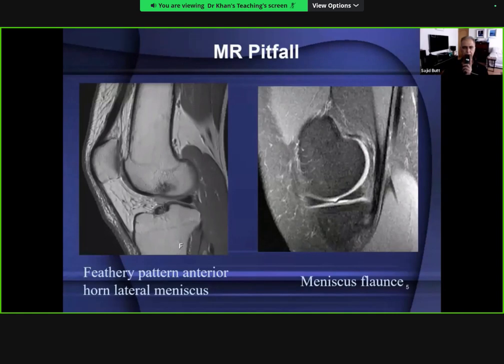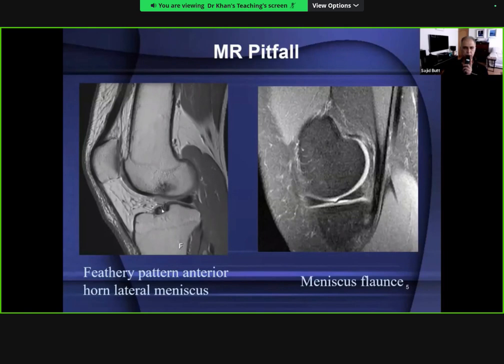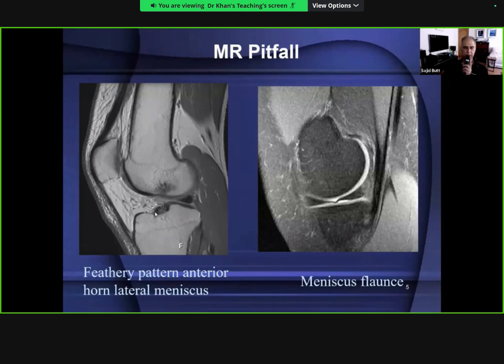A pitfall: the anterior horn of lateral meniscus where it attaches to the tibia can normally show a feathery appearance. This is because the tibial attachment of the anterior cruciate ligament shares an origin with this structure, and where ligament fibers are interdigitating it can appear feathery. Inexperienced radiologists may call this a possible tear. A tear of the anterior horn of lateral meniscus almost always tends to communicate with the body of the lateral meniscus, so an isolated apparent tear of the anterior horn should be under-called.